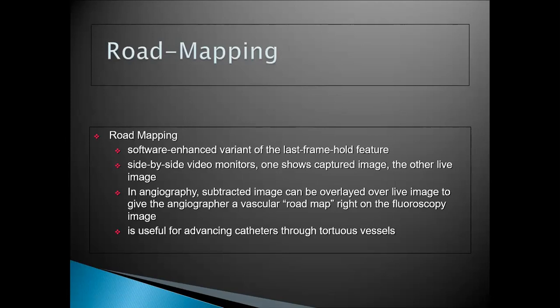One of the monitors shows the image that has been captured and the other shows the live image. You can say that one is the stereo monitor, the other one is the video monitor. So the one for video shows the live image, while the other one shows the captured image.